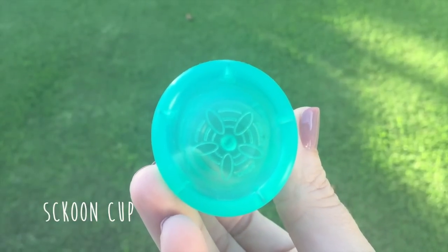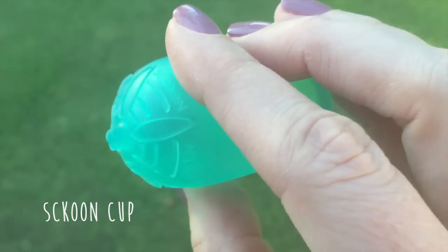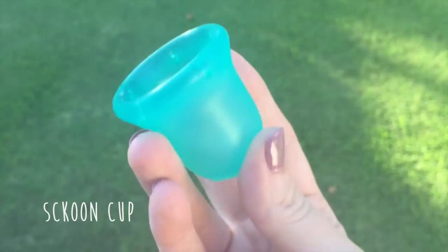Now we have the Sckoon Cup size 2, also made in the USA. It is made from medical grade silicone and I have it in the color harmony. It has a diameter of 45 millimeters, a length of 50 millimeters, and a capacity of 30 milliliters.